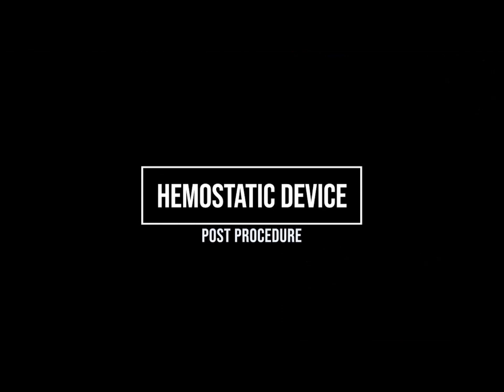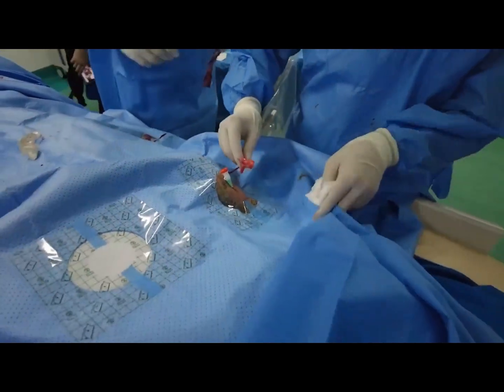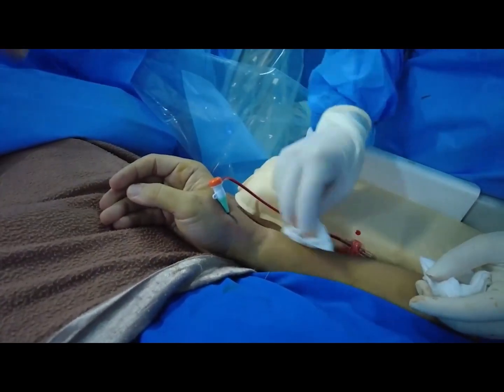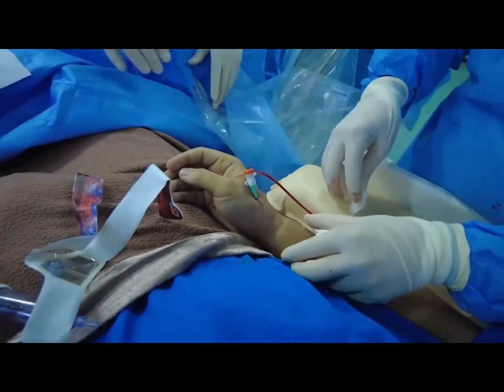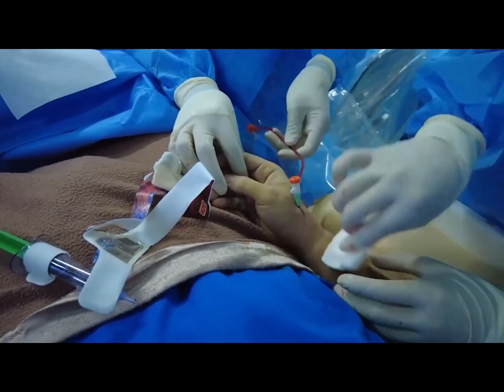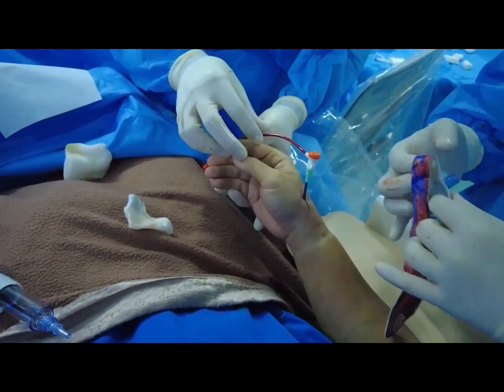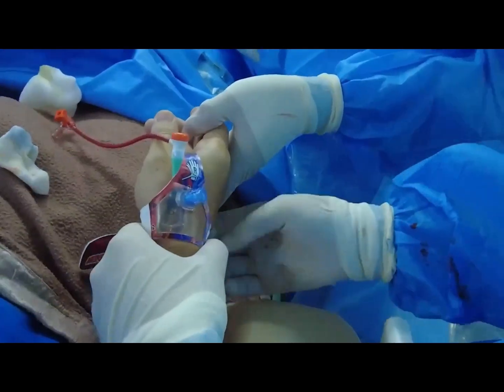So to make a clear understanding, this is what we did previously. For the hemostatic device, we clean up the access. So even after some long hours of procedure, the patient felt very comfortable. As you can see, the hand position is in normal upright position, and then we pull for another 1 or 2 centimeter and put the occluding distal near to the access, around 1-2 millimeter from the puncture site.